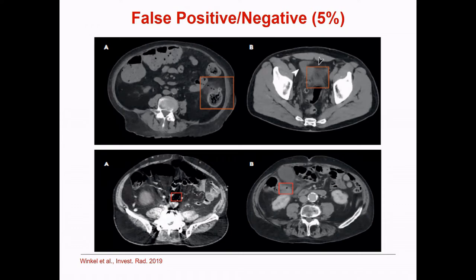That's one thing. And it's astonishing to me that there is no image-based quality control in radiology in Europe. You can do it, but you don't have to. The only thing that is established is dose control in CTs. But dose control doesn't say anything about the quality of the image. Actually, it's the other way around. I can give you a 0-dose CT, I just put you in and out, and I give you no dose. It also has no diagnostic value. Low-dose CTs have a lower diagnostic value, and this is a trade-off. So dose optimization, which is mandatory, does not say anything about image quality. That to me is fascinating, because we pay a lot of money for imaging, although it's not quality controlled.